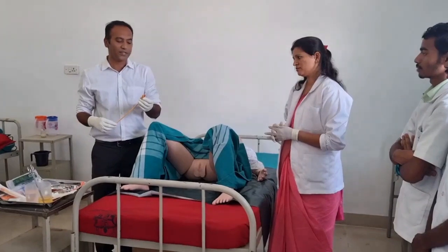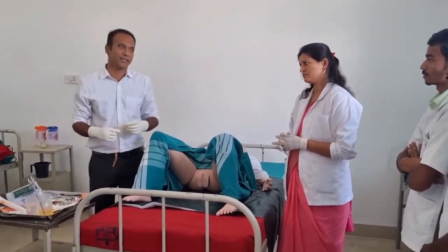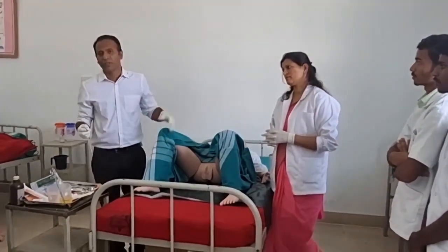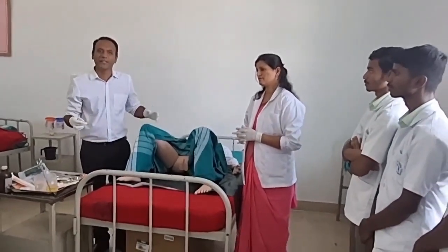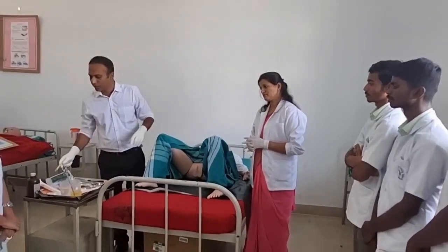The size of the catheter also matters. What is written here? 16. In females, a 14 to 16 French gauge is enough. If the female is less than 12 years of age, we can select between 12 to 14 French gauge. So now let's go with the procedure.